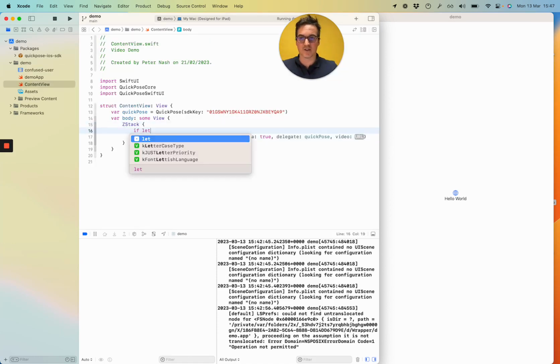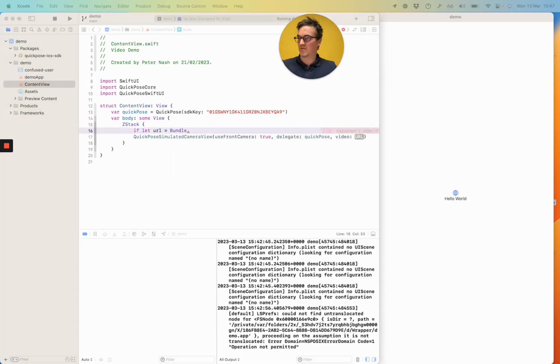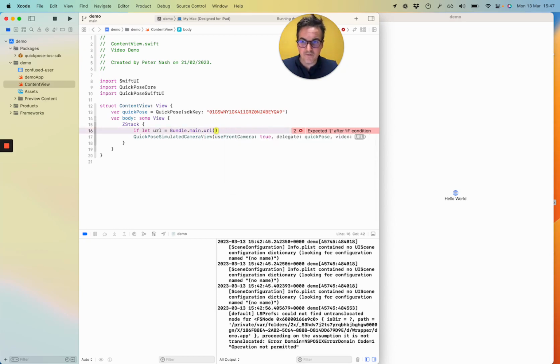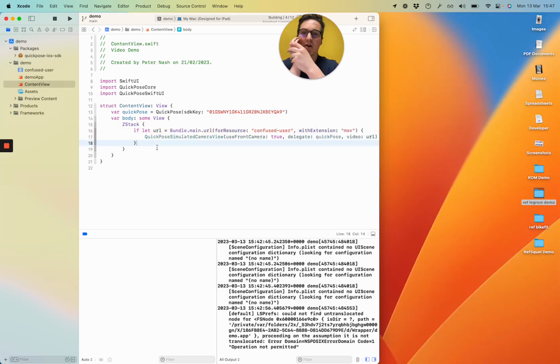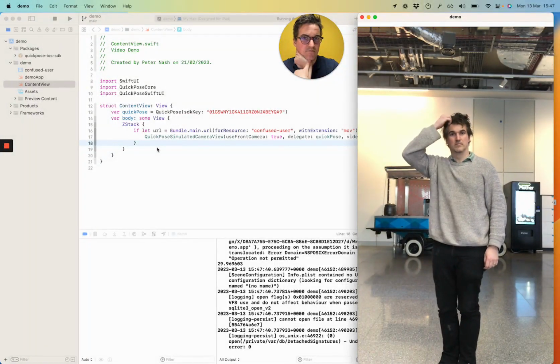I'm going to do an if let, so if I do forget my video later, it will throw a warning. Oop, not that one. For resource, cool. Confused user, an extension. Okay, so if I run that now, I should have my video playing. There we go. What to do now?